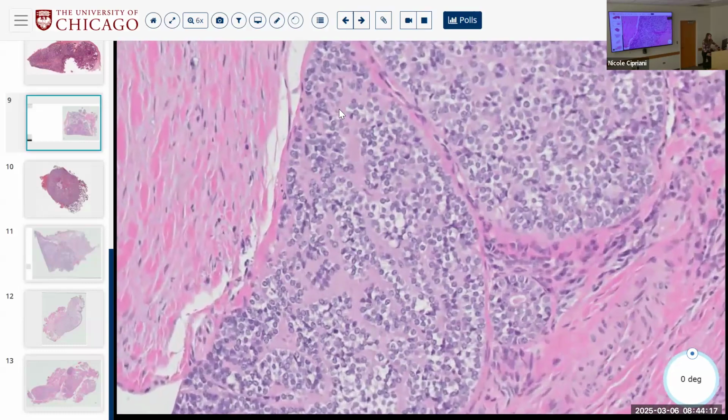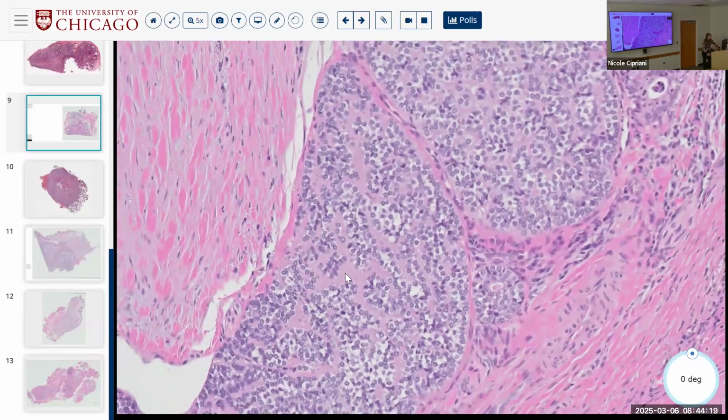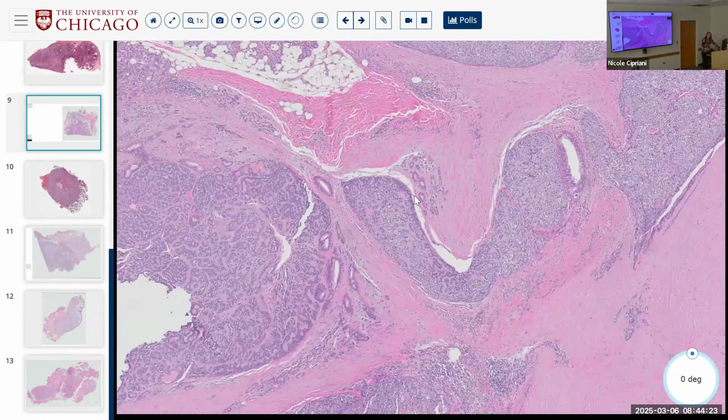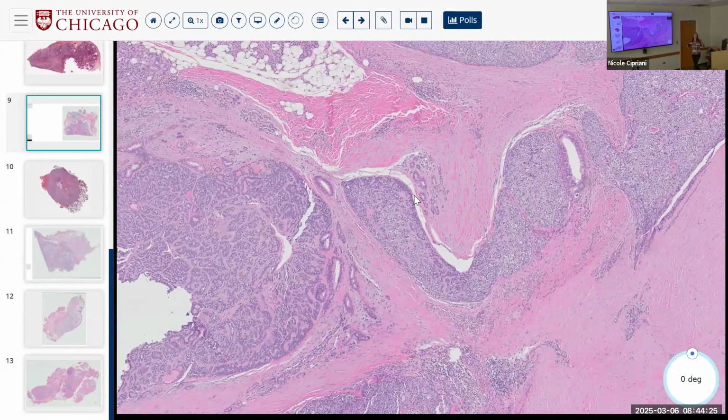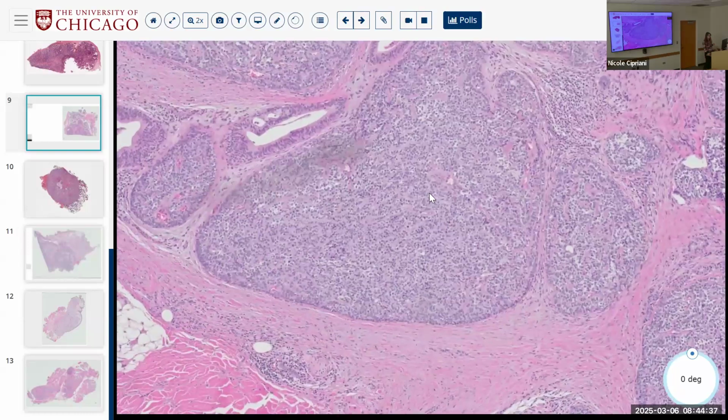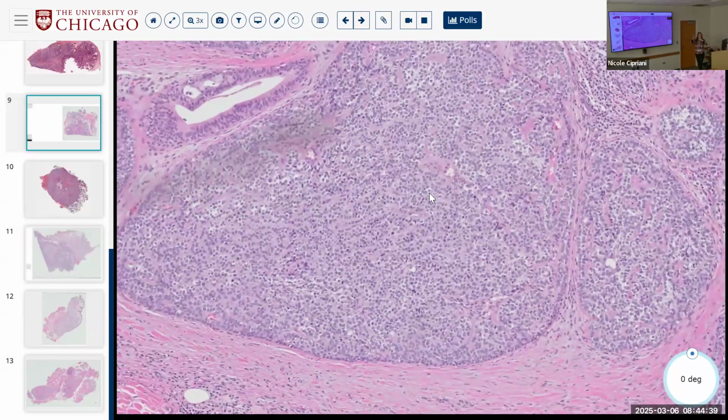Yeah, so the things that might favor a basal cell adenocarcinoma might be this hyalinized basement membrane material. But remember that if you have a tumor that has myoepithelial cells in it, you can have basement membrane material being secreted even if it's not a basal cell adenocarcinoma. What's a little bit maybe missing from the morphology of a basal cell adenocarcinoma is those jigsaw puzzle architectures, right?